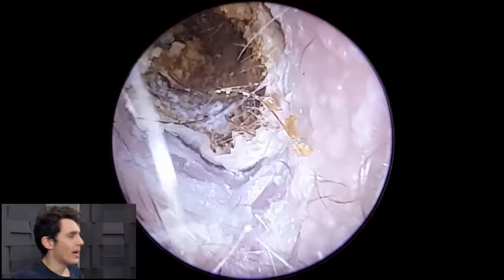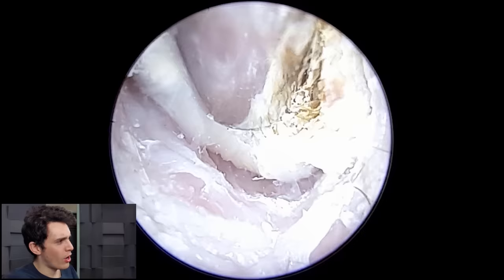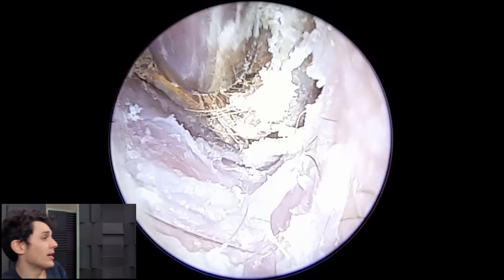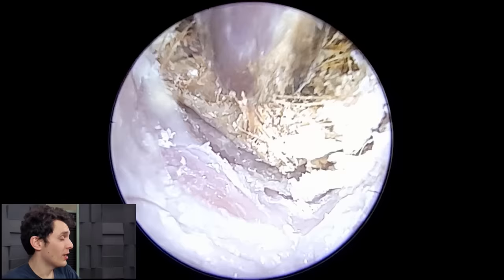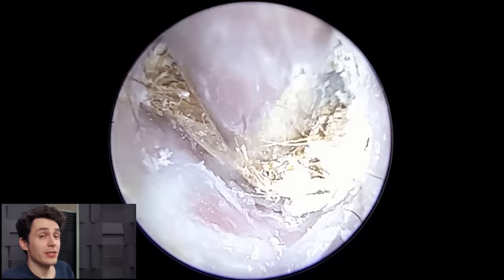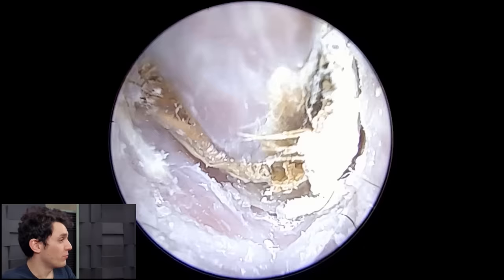It's also entwined with a lot of hair, which you'll see throughout the video, and that makes the extraction more difficult. When hair is entangled with dead skin and wax it gives the whole plug a lot of structural strength — similar to the principle of adding sawdust or wood shavings to ice when you freeze it. You end up with a super-strong ice called pycrete. Interestingly, in the Second World War the British were going to make a ship out of pycrete, but quickly realised that was a terrible idea.